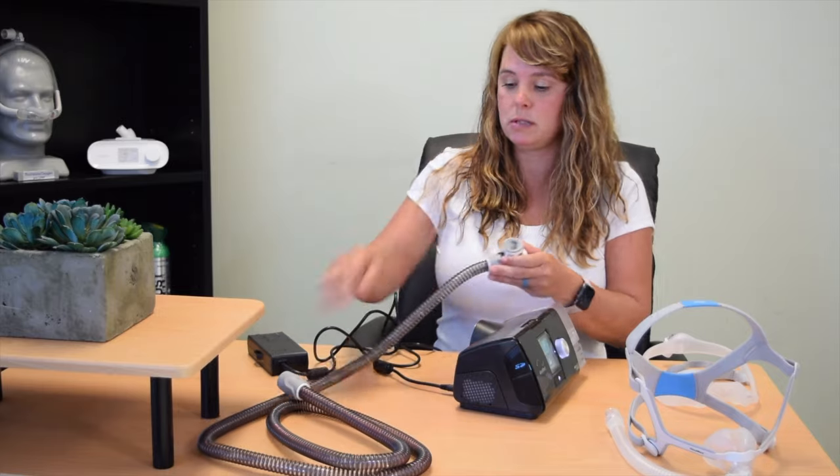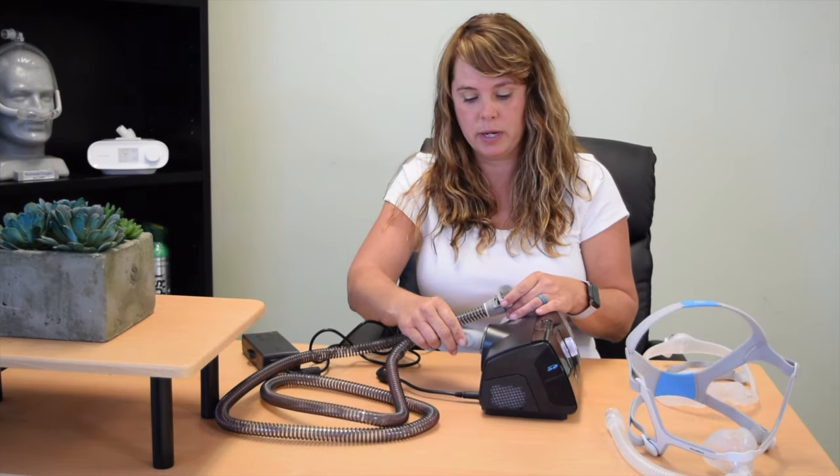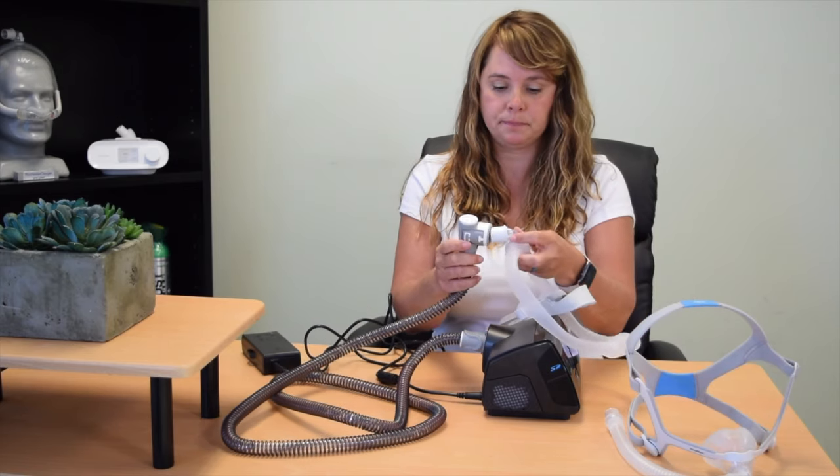Number three issue is the tubing. On this tubing you can see the ends are very different — this is a heated hose system. If you were using a standard tubing, the ends are going to be identical and this would be a non-issue. But if you were to put your tubing in incorrectly — with this end going to the device and the other end into the mask — it's very bulky, very heavy, and it's not creating a seal, so you're going to have a lot of leakage.